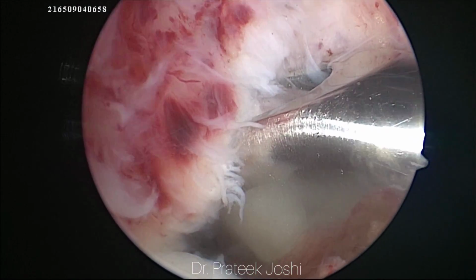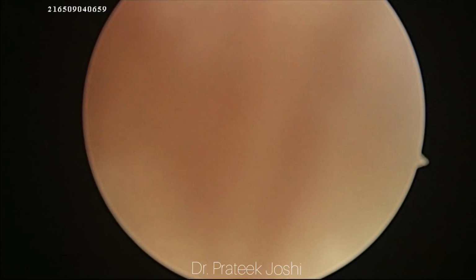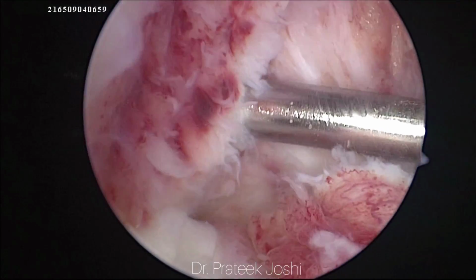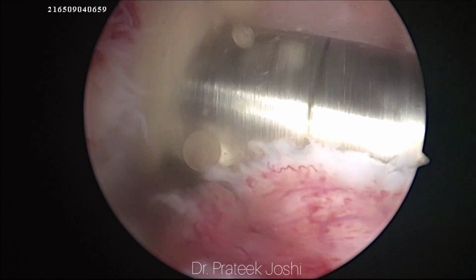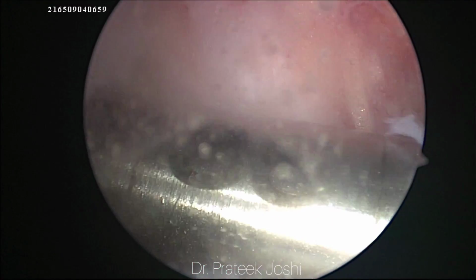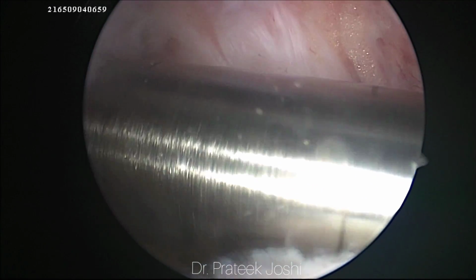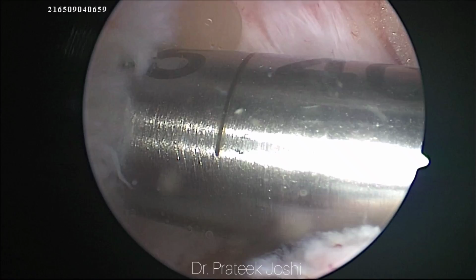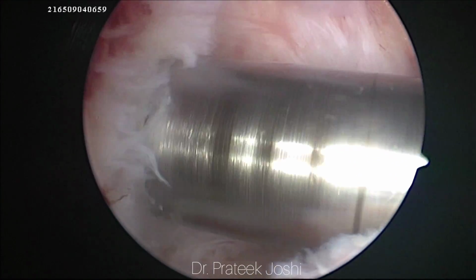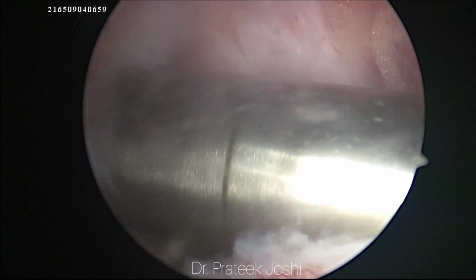So as you can see, we have drilled the guide wire through the lateral femoral condyle in the ACL footprint, and now I am going to remove the femoral guide, and drill with a 4.5 mm endobutton drill bit over the guide wire. The laser markings over the endobutton drill bit give us a rough estimate of the length of our femoral tunnel. In this case, we are feeling the resistance of the lateral femoral cortex at around 35 mm, so we are anticipating the length of the tunnel might be around 40 mm.